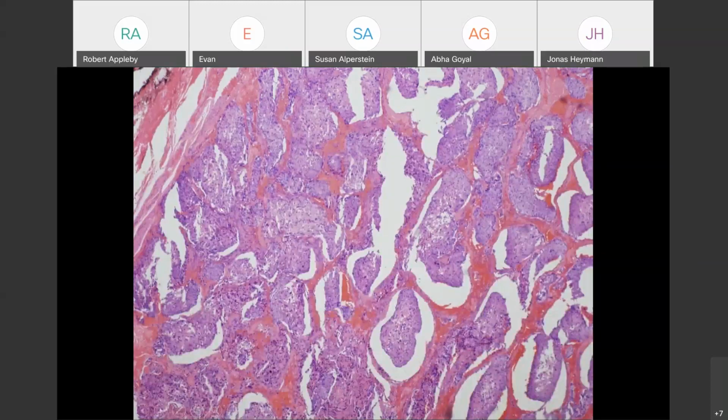And then here's a tissue follow-up, because there was a definitive diagnosis before surgery. So surgeons know how to avoid bleeding, so it's all clotted, and so just excised. And they say, how come it's so different, cytology, histology?